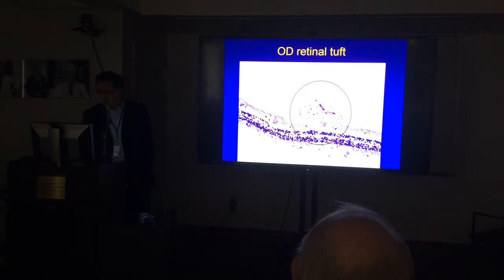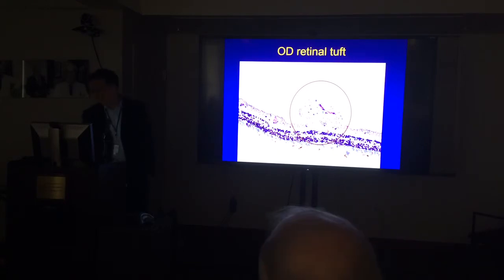An incidental finding we happened to notice was a retinal tuft. A cystic retinal tuft is a congenital abnormality that's composed primarily of glial tissue. The main clinical finding of something like this is that classically you're supposed to get strong vitreoretinal adhesion from lesions such as this, and you can sometimes get small round holes or horseshoe tears around here. Retinal tufts are present in up to 5% of the population, but it is thought the actual risk of retinal detachment is low, probably well below 1% for any particular retinal tuft.